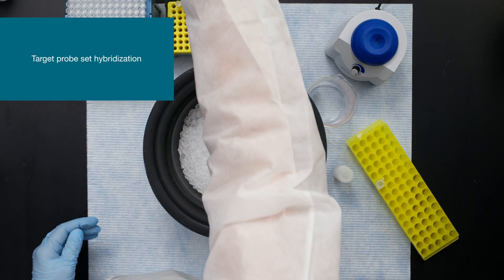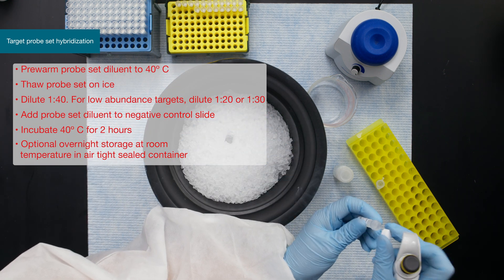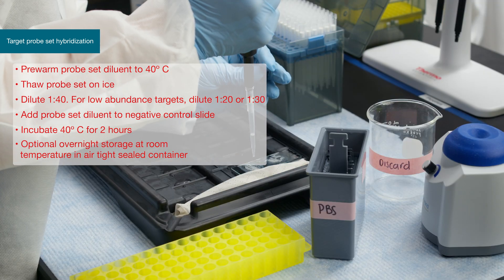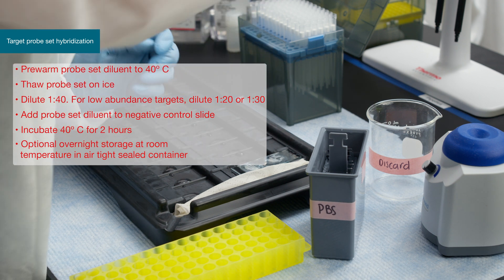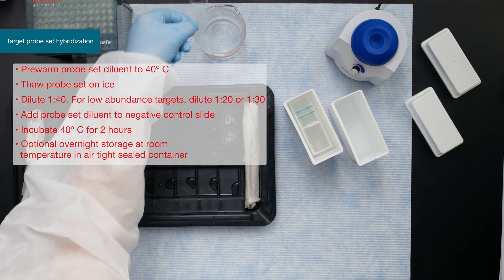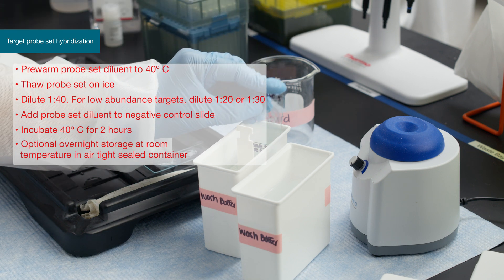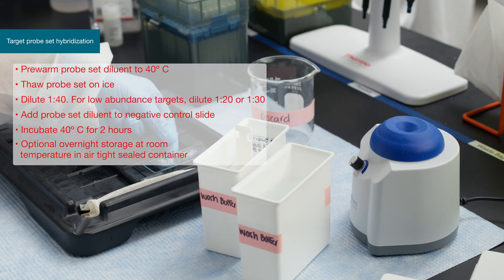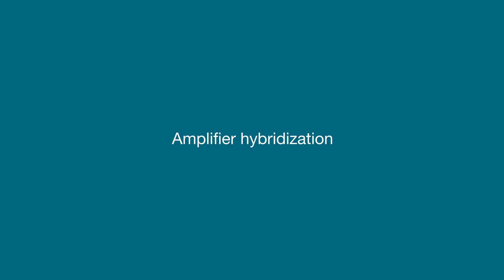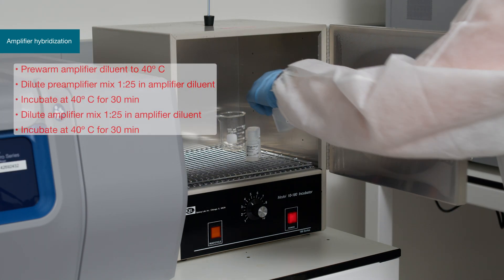Prepare the working target probe set solutions by diluting the VUE-RNA probe sets in pre-warmed probe set diluent. Lay slides flat and cover with the probe set solution. Transfer to the dry oven and incubate for two hours. After incubating, wash the slides three times with fresh wash buffer. If performing the protocol over two days, slides can be stored at this step in storage buffer at room temperature for up to 24 hours. If slides were stored, washes are required before moving to pre-amplifier hybridization.